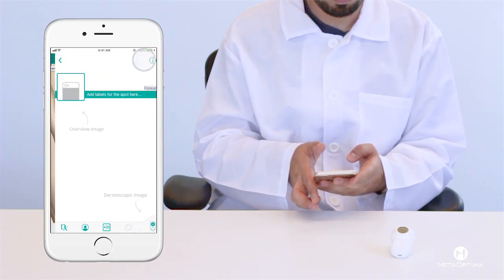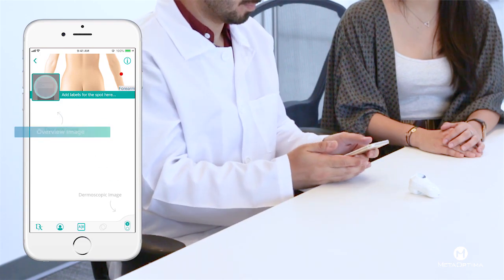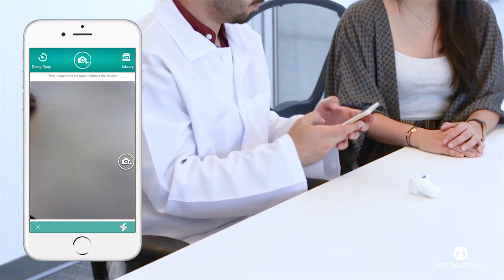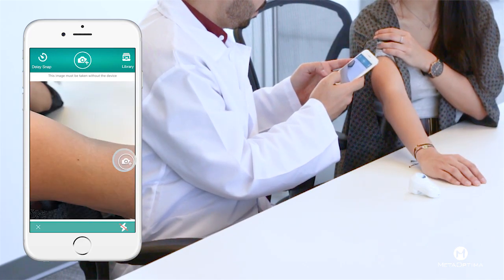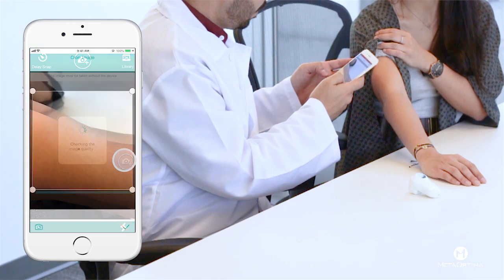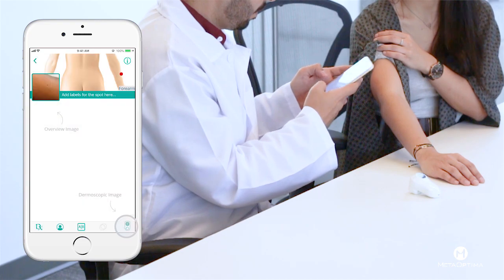Tap next to add images. Let's start by adding the overview image. Select the overview icon and position yourself to take the image. Tap the screen to help focus, and when ready, take the image by hitting the camera icon. Next, you may crop it. Once you're happy with the image, hit the checkmark button to save.